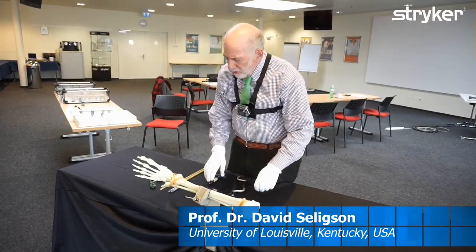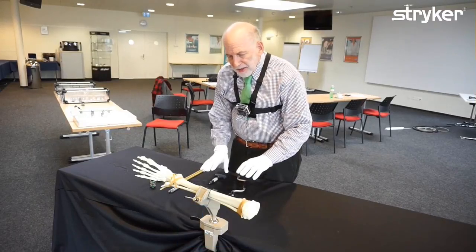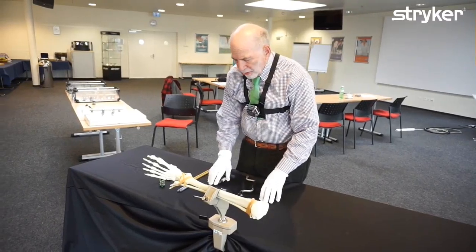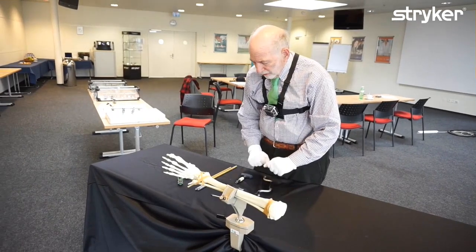I'm going to show you some simple frames today. They may not be exactly the frames you are making, but I try to make frames that are as simple as possible, as sturdy as possible, and as functional as possible for the patient. I call these friendly frames.